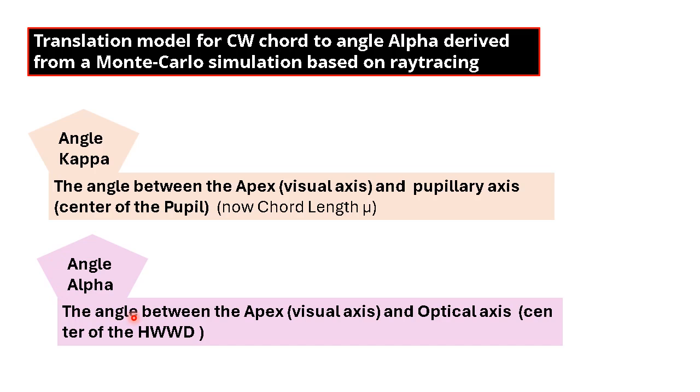Now, in the Placido disc-based topographers, because they take the measurement of the visual axis and the pupillary axis from the surface of the cornea, and the surface of the cornea is magnifying the image, it will not give the proper location of the center of the pupil. In reality, it will make it more shifted, more temporally, and the image will be more magnified. So the calculation will be a little bit different and is not that accurate.